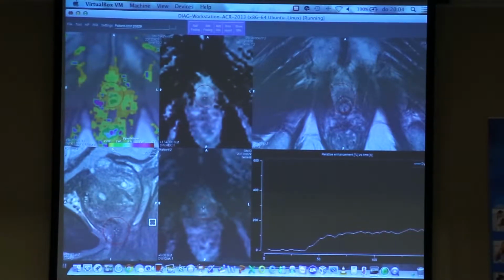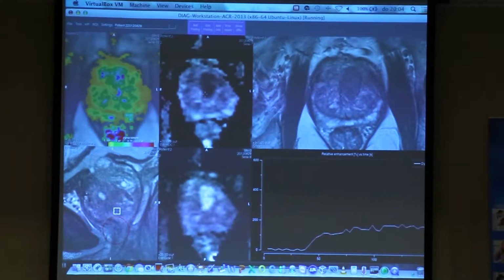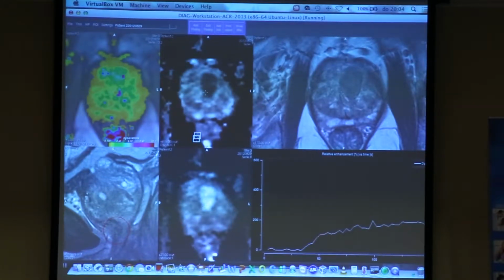And now let's make a journey through the prostate. This is how we work. Actually, I can steer this computer from here in my office in Nijmegen. So let's look at this patient. We go up, up, up, up, up. And there's the tumor. Okay, let's go to the tumor. Oh, sorry. Again, the black dot here.